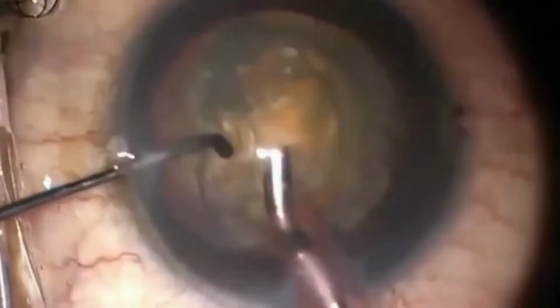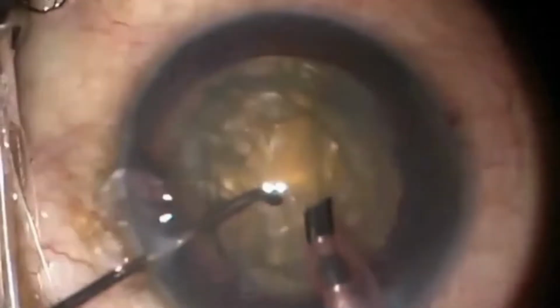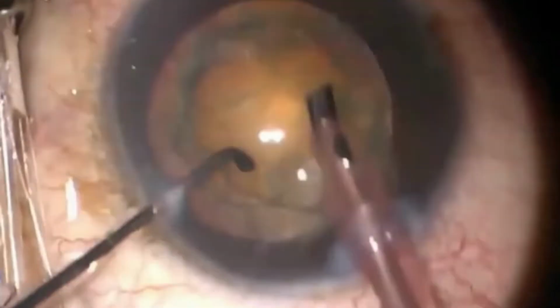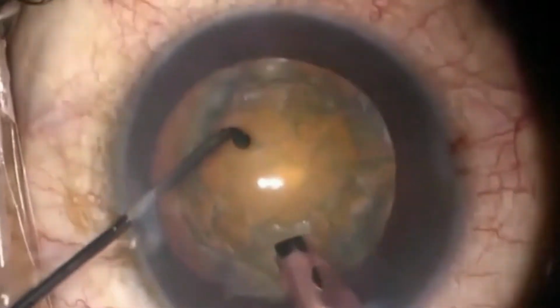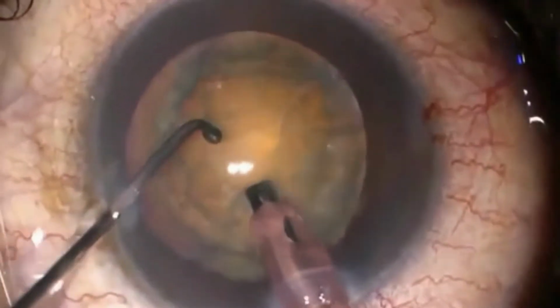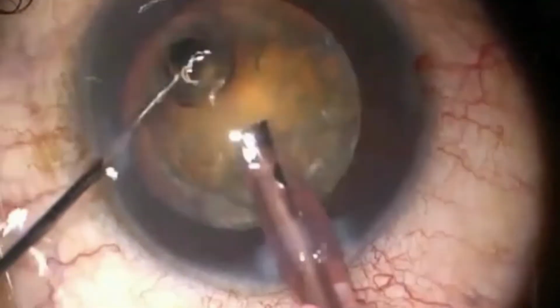The sleeve of the Phaco tip must adapt perfectly to the incision size to avoid fluid leakage through the main incision, an important issue when using high vacuum. The sleeve must be retracted backward to expose at least 1 mm of the metal tip so that it can penetrate the nucleus. Before the tip is impaled, the superficial epinucleus should be aspirated.